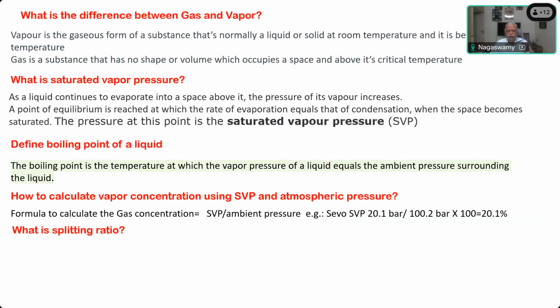Whereas in our modern vaporizers, we have the percentage dial setting, 0.5%, 1%, 1.5%, 2%. So depending upon the dial setting, a part of the fresh gas flow coming from the flow meter will enter into the so-called vaporizing chamber, which contains the volatile liquid anesthetic agent, pick up the vapor, and then exit through the other end of that vaporizing chamber and join the mainstream of flow, the fresh gas flow, which is going without entering the chamber with the so-called bypass.